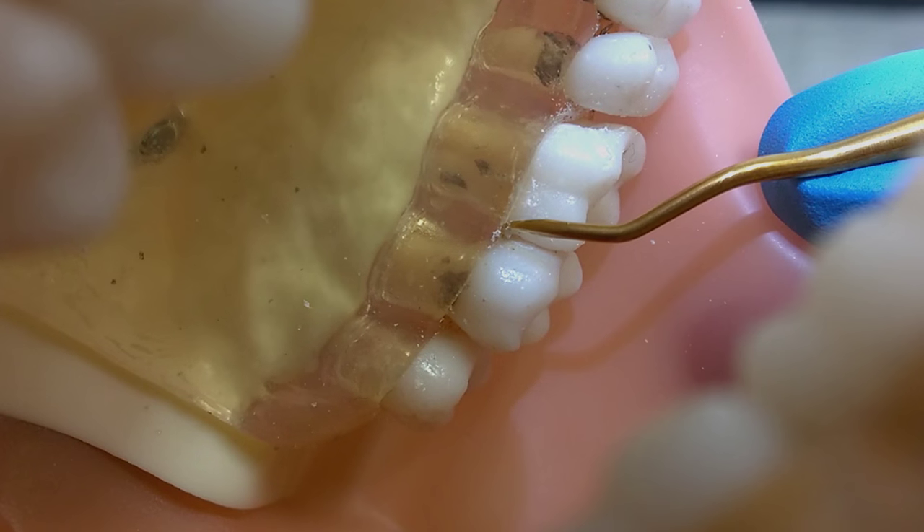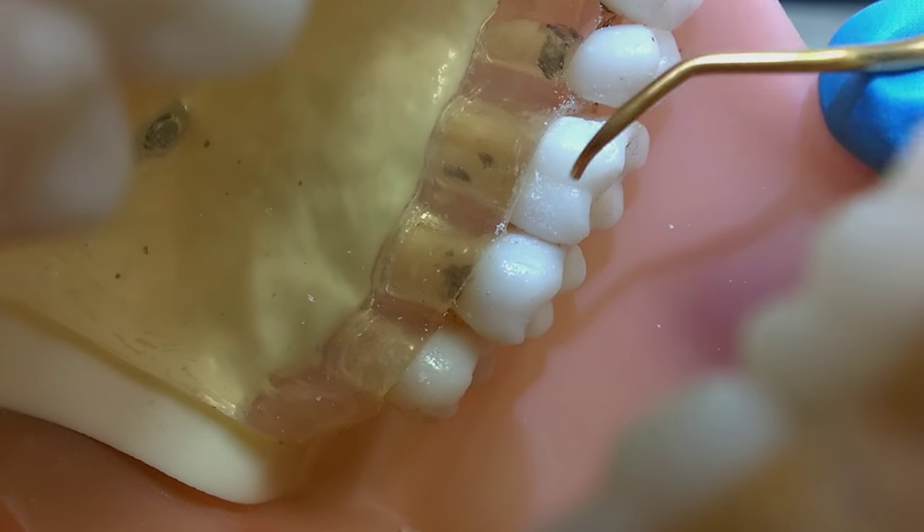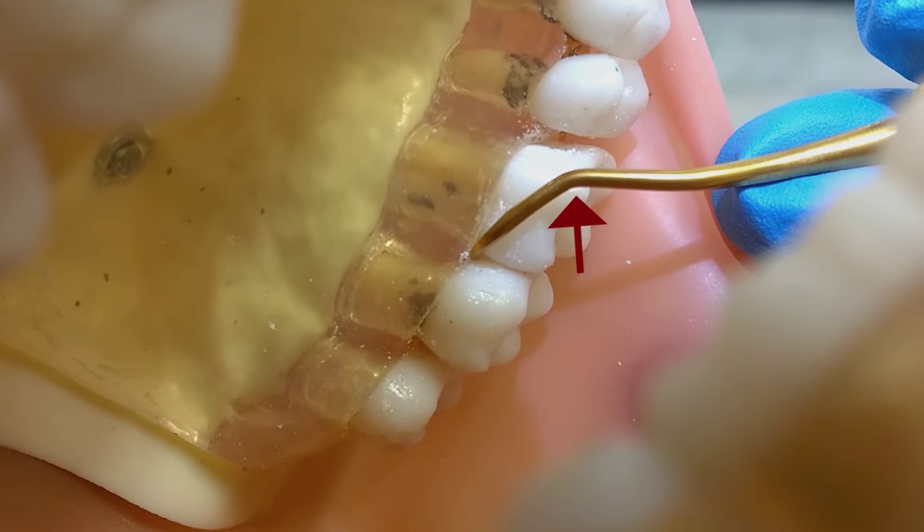To select the correct working end, you look for the shank to be parallel with the long axis of the tooth and for the elbow to point posteriorly. If we view the opposite end, the shank comes across the tooth and the elbow points anteriorly.